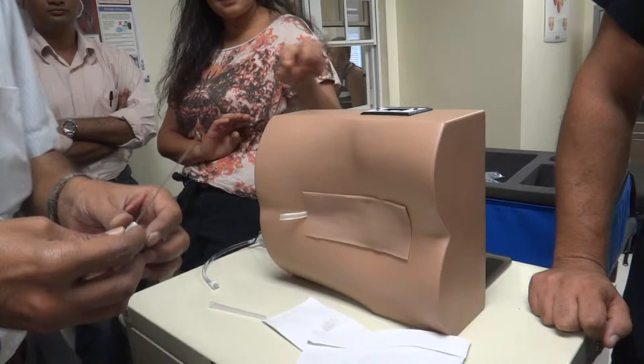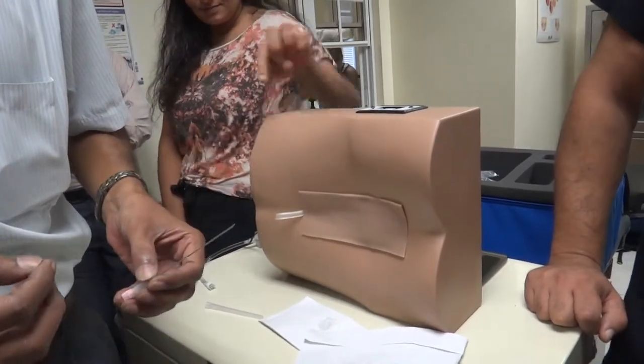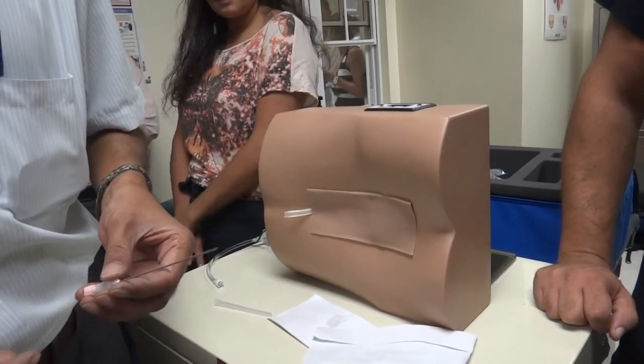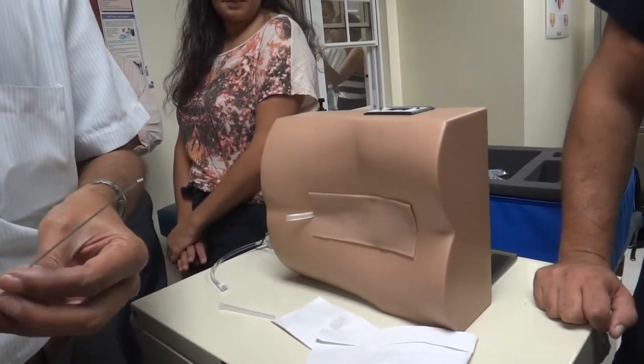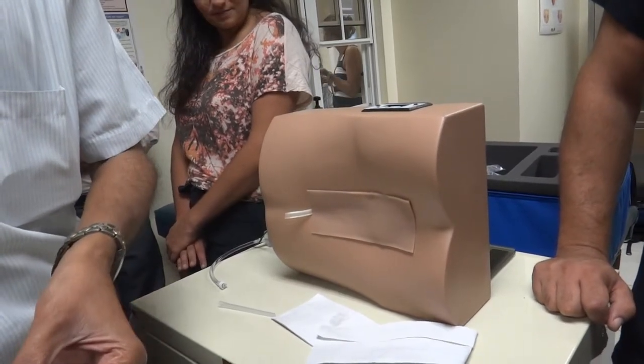We put a tincture benzoin seal or autologous blood graft here, then send the patient. Put the patient flat for 24 hours. It looks simple, but when you do it, you'll find there'll be problems — you will hit the bone. Does it matter which way the bevel is when you put it in? No. Here, because we're going absolutely horizontal, it doesn't matter.